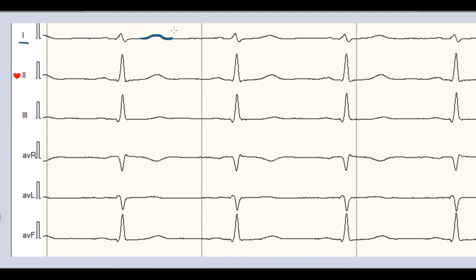Normally, in standard leads T wave always positive in first, second, and AVF. AVR always shows negative T wave. T can be positive, biphasic, and even negative in third standard leads and AVL.